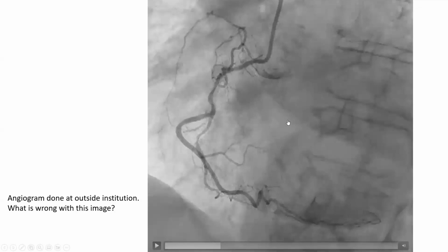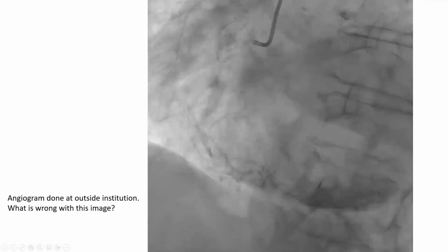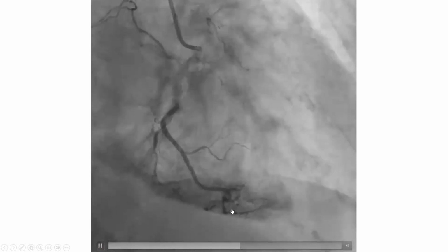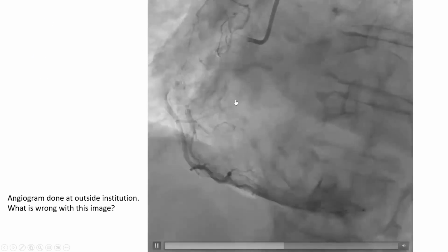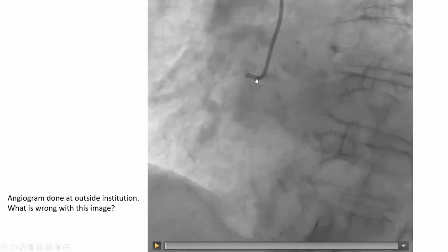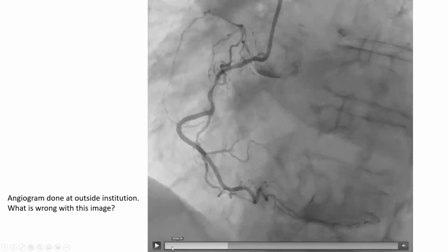And this is an emergency. You see that angiogram, my immediate reaction is to pull out that catheter. They didn't have the right reaction because they kept taking pictures, and look at that. More myocardial stain. And those are the 3 steps here. So 1, you're occlusive with your catheter, you get damping or ventricularization. The second thing you get is dye stain in the vessel and in the myocardium.